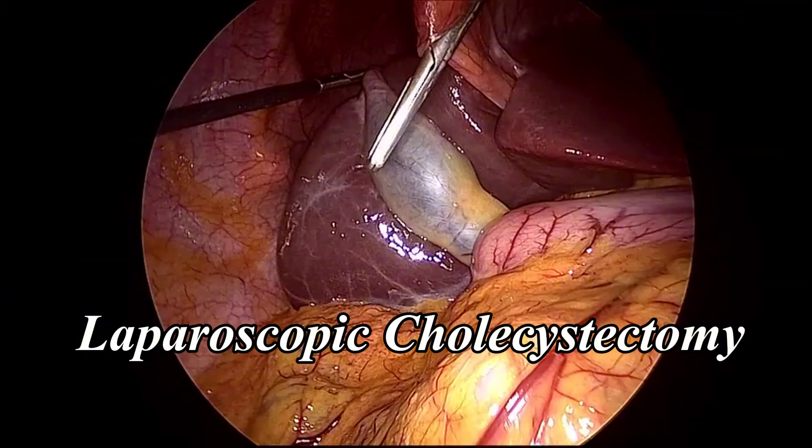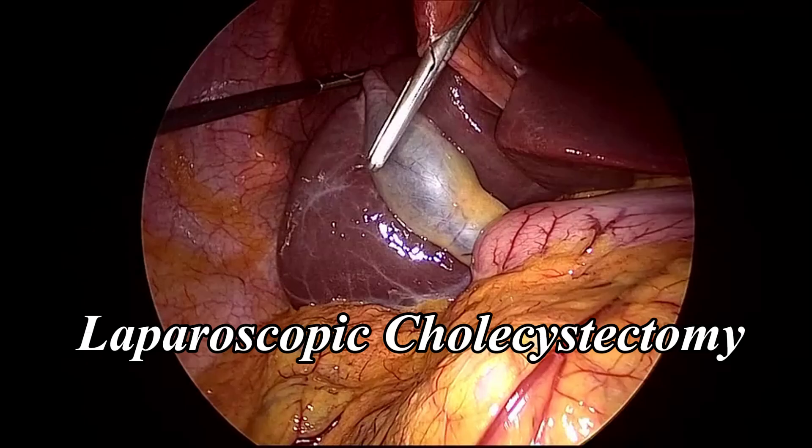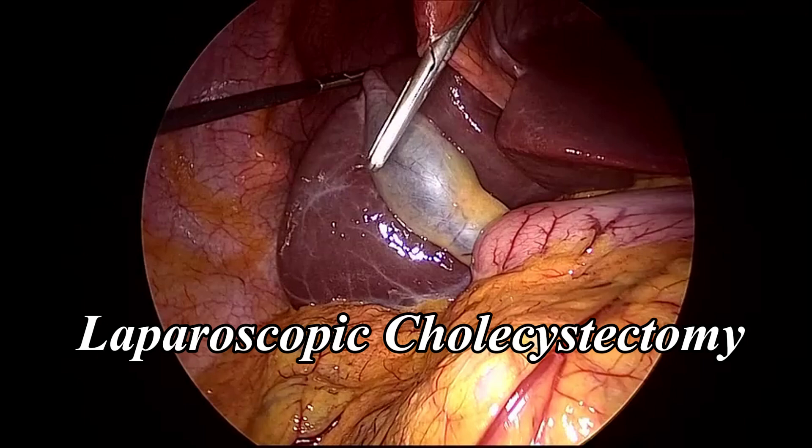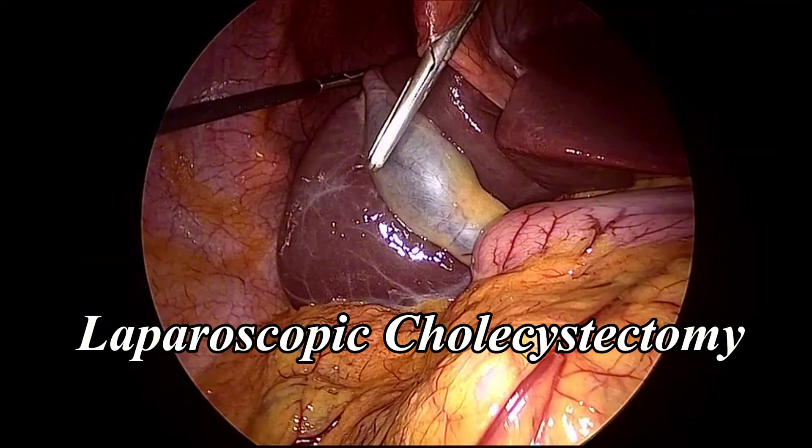Step 1: Positioning and Setup. The patient is placed in the supine position under general anesthesia, with both arms tucked. A Foley catheter and orogastric tube are typically placed. The abdomen is prepped and draped in sterile fashion. The surgeon stands on the left side, with the assistant and monitor positioned on the right.